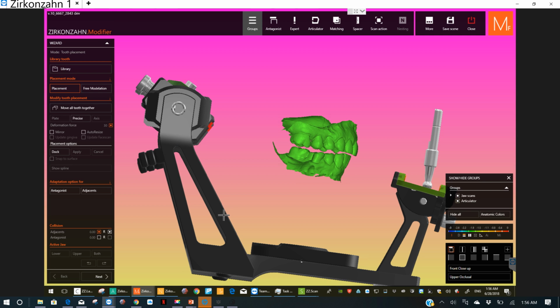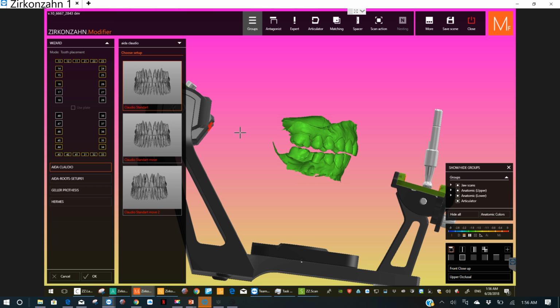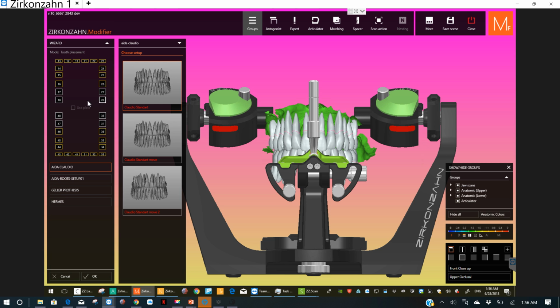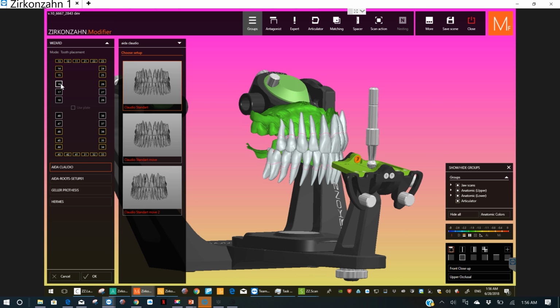We've decided where they should be, and now you come here and you have to remember to hit library to tell the computer to bring some teeth in. Our bridges generally have 12 teeth. We don't put second molars on there, so over here it kind of automatically already does that too. So the yellow ones are the ones where there's teeth. If you have a different amount of teeth you just click on that to add more or get rid of it. But we want 12 on top, 12 on bottom. So it already puts them in there.